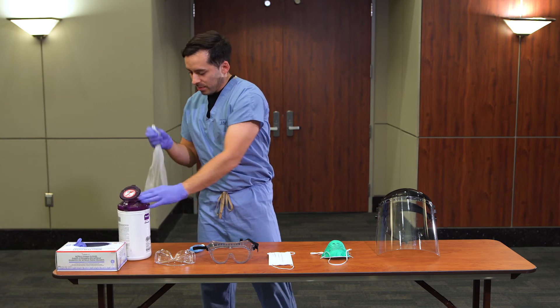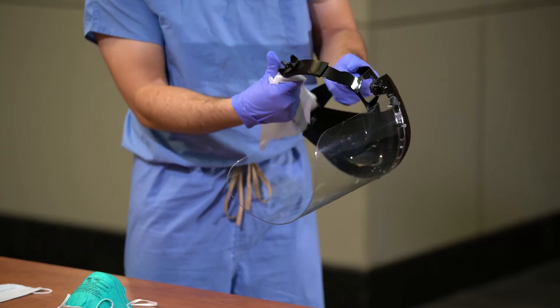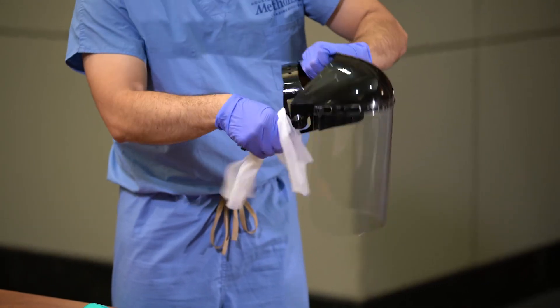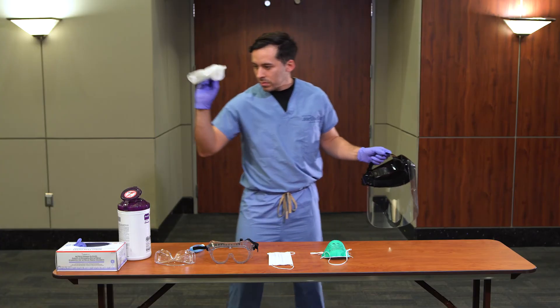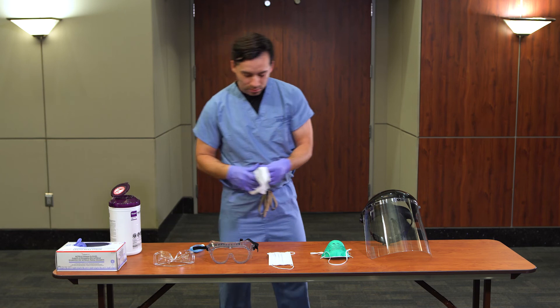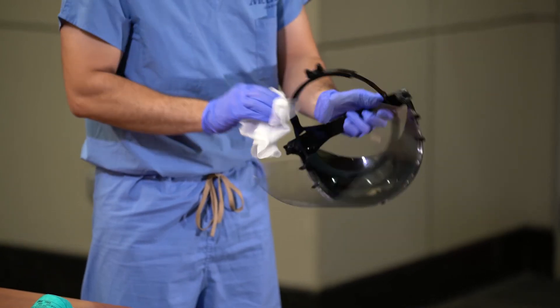Wipe the harness. Discard the wipe and wipe the interior of the shield. Once disinfected, store the face shield on a clean surface.